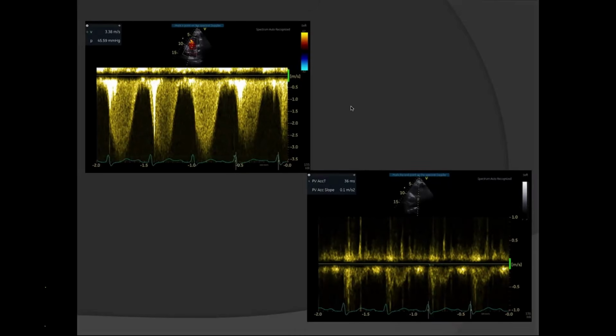What is this? 60-60 sign. 60 sign. So who said that? Again, Dr. Ranjan. And another girl, who is that? Dr. Richa, ma'am. Okay, Dr. Richa. She has done this case. She will not get this prize. So this is the 60-60 sign.